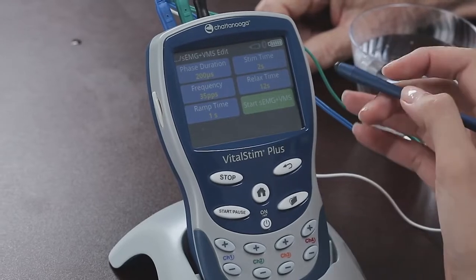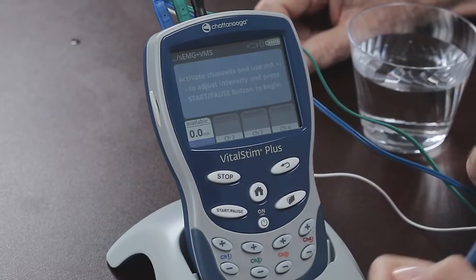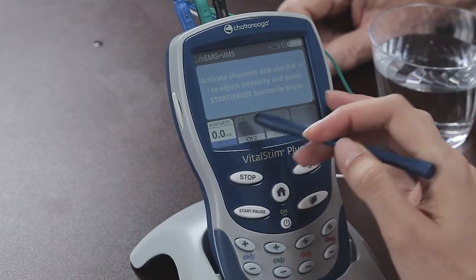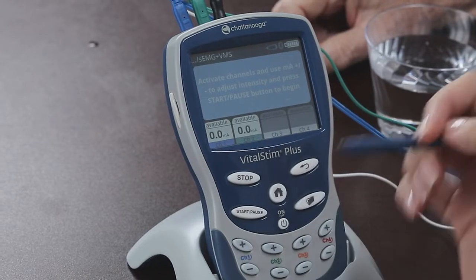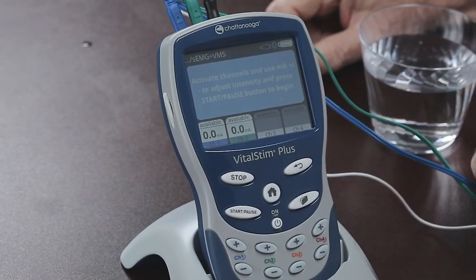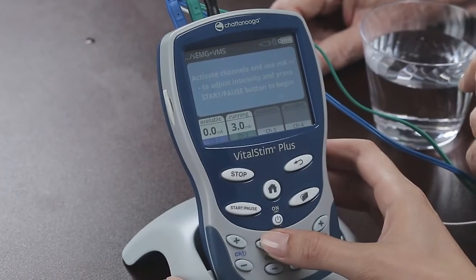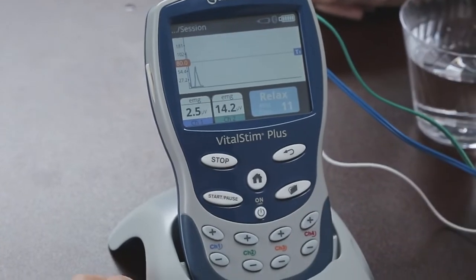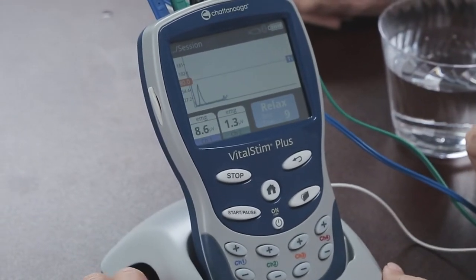Press the Start Surface EMG plus VMS button and we bring up this screen. Channel 1 is already active and it will remain active because it is the triggering channel. But in this example, we are not going to stimulate through it, so we'll leave the intensity at 0 milliamperes. We select channel 2 in order to increase the therapeutic intensity. Let's do this for this patient as we have done before. And once we are at the right level, press Start, pause, and the machine will start in relax mode.